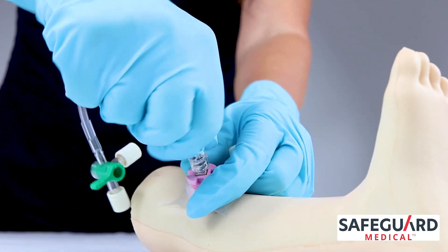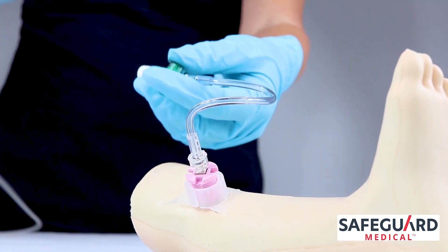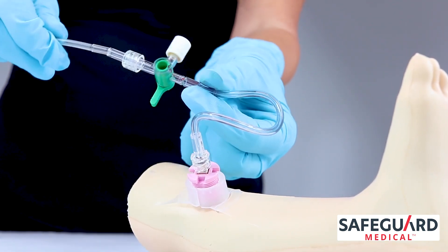Connect the three-way stopcock extension set included in the GO-IO kit to an IV line. The extension set allows for the simultaneous administration of medications, fluids, and blood products.